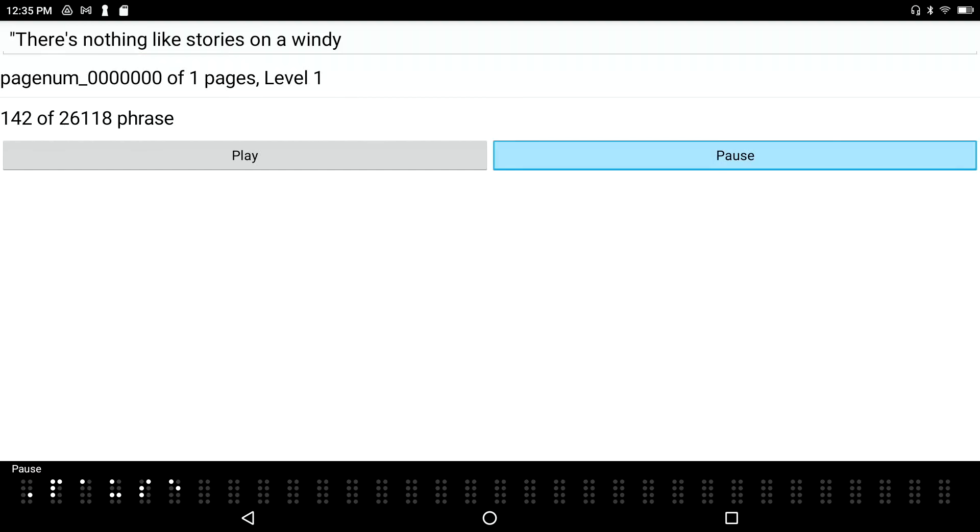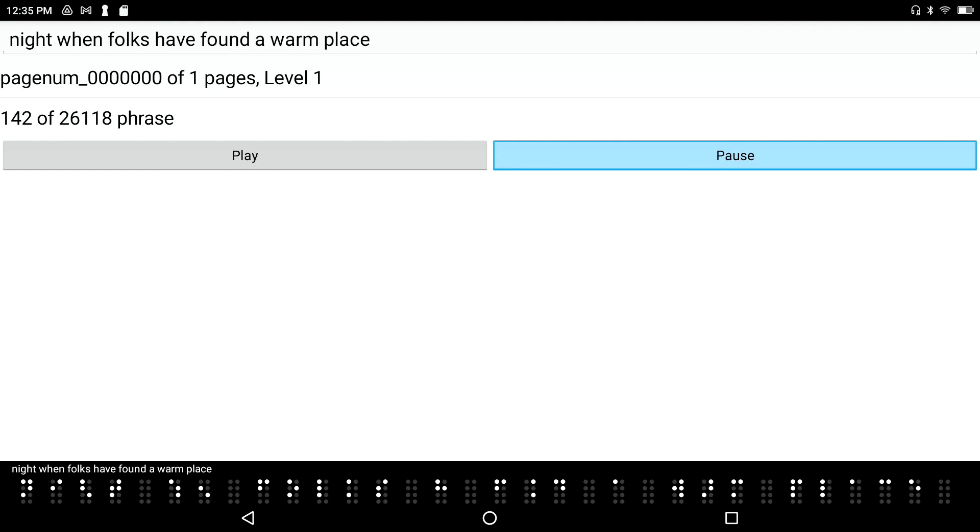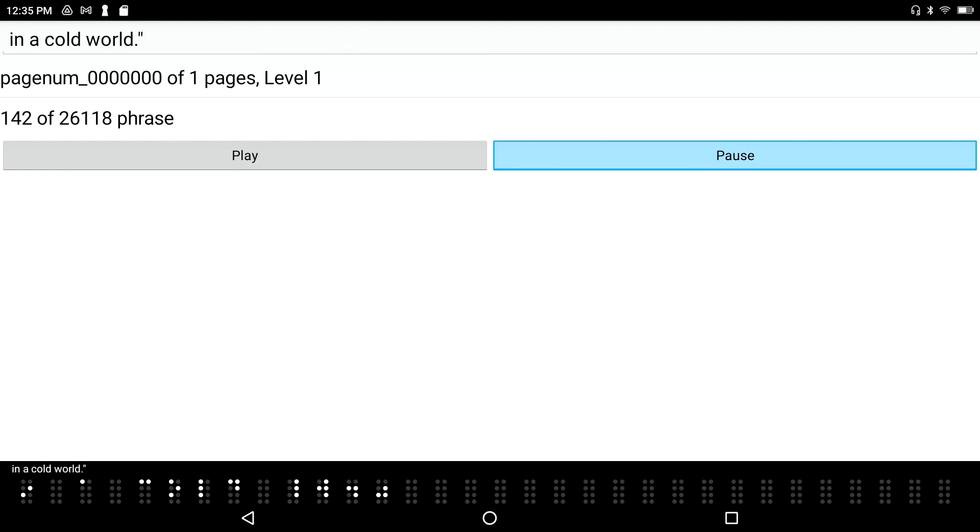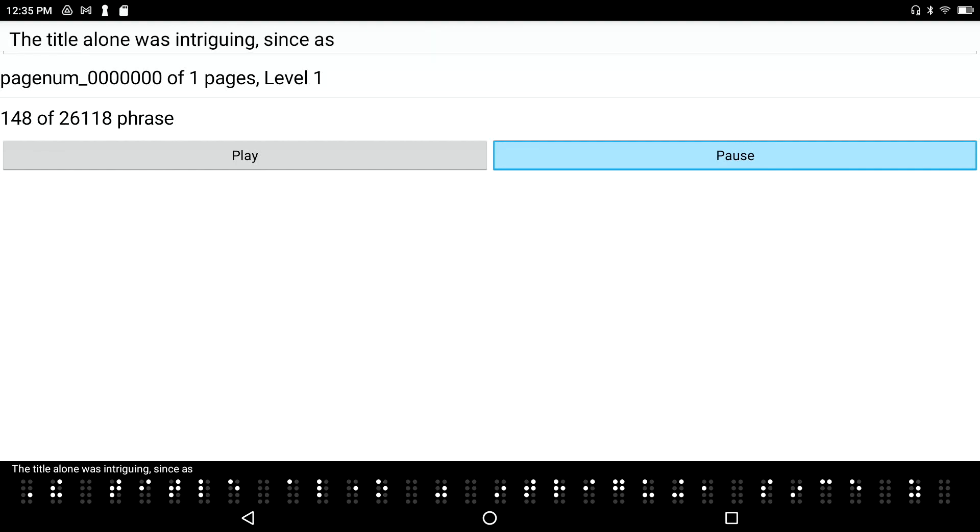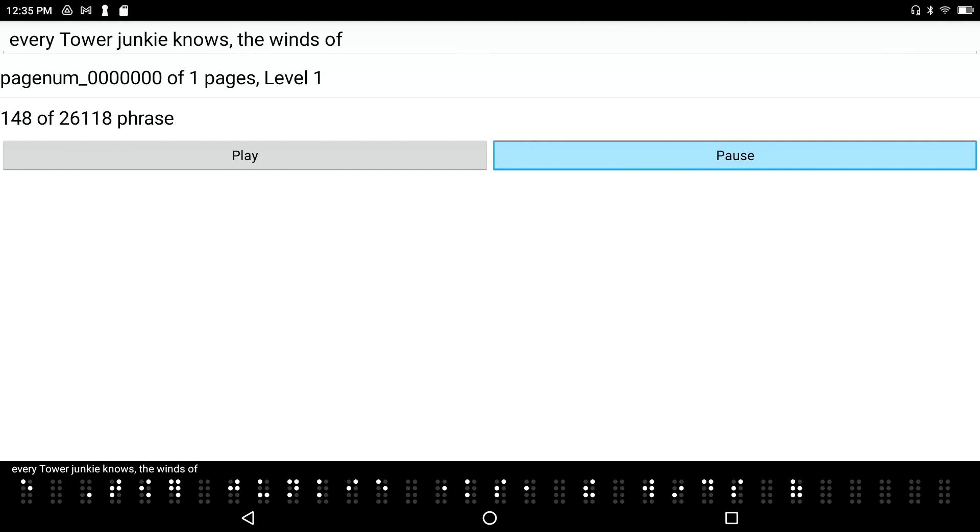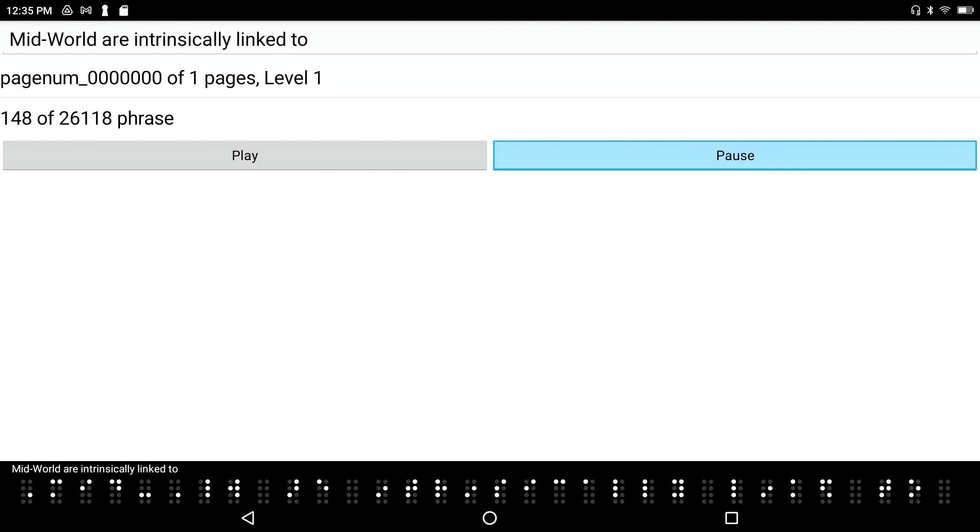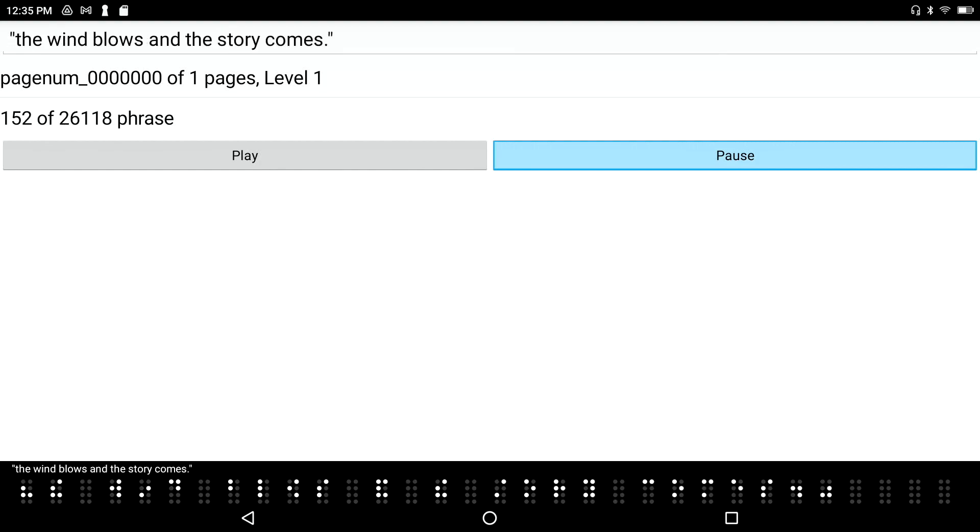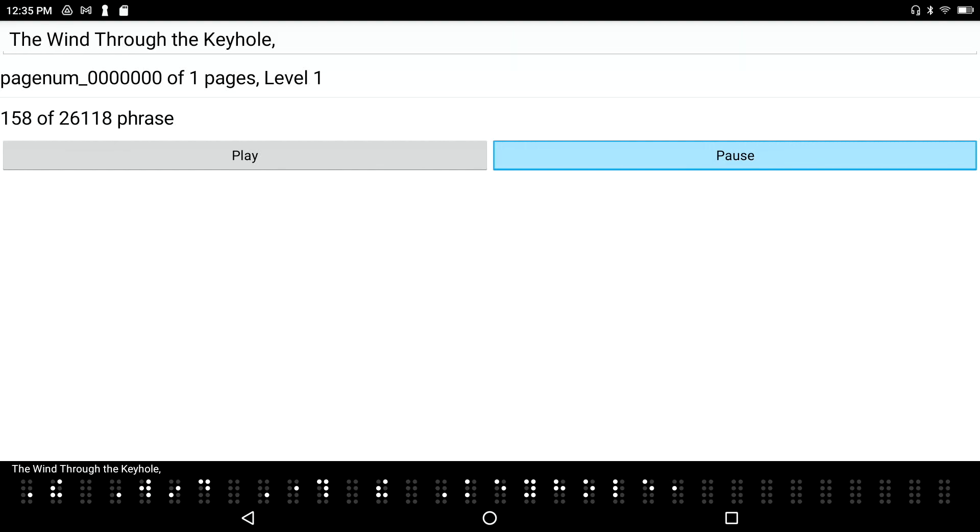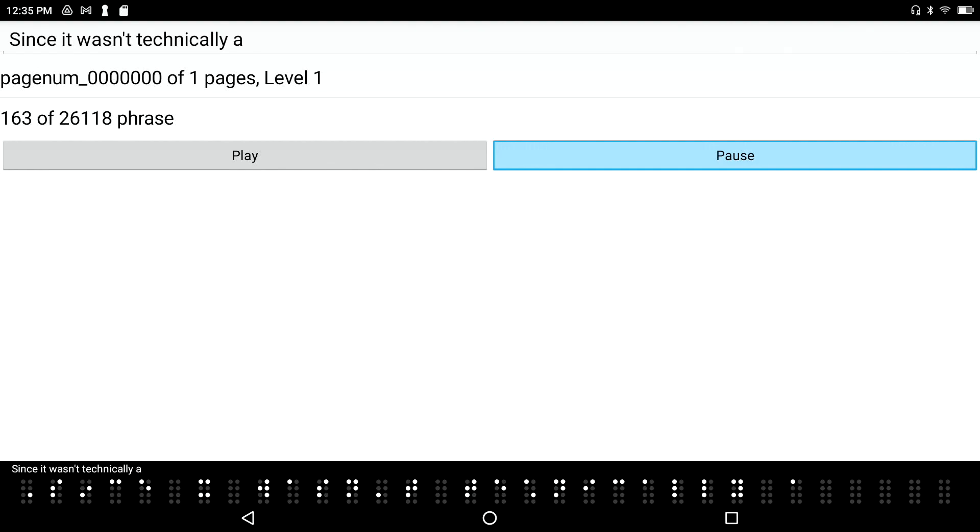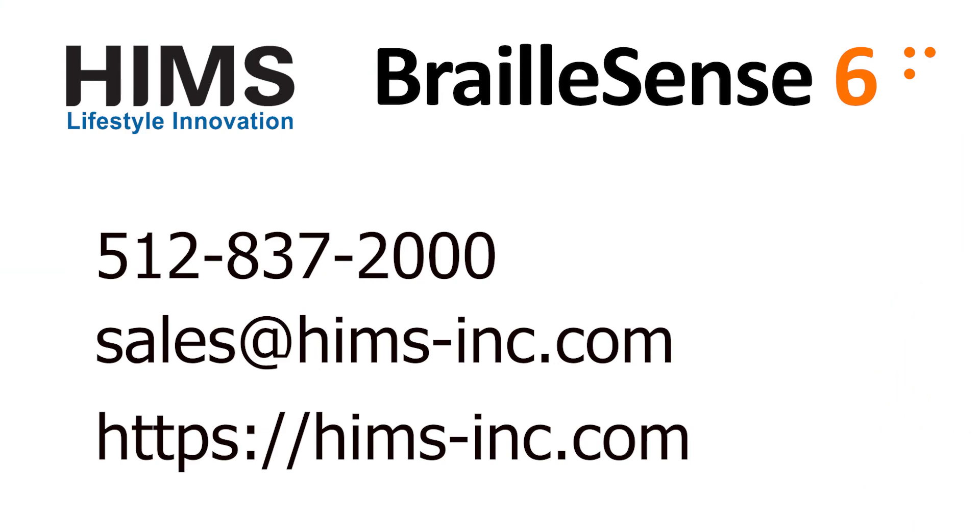a book that you've downloaded from Bookshare. Now I'm just pressing my scroll buttons and I can read the whole thing in Braille. Oh my gosh, this is beautiful. Happy reader. So that's how to download books with the Bookshare app and read them in the HIMS Daisy book reader.